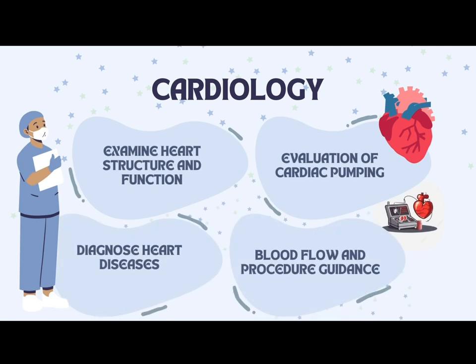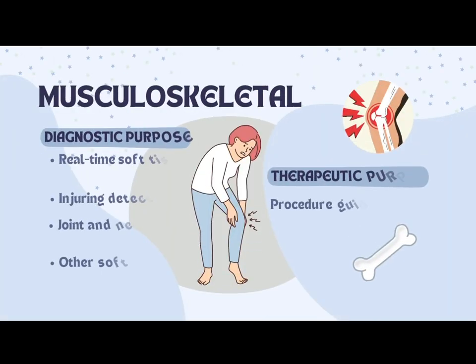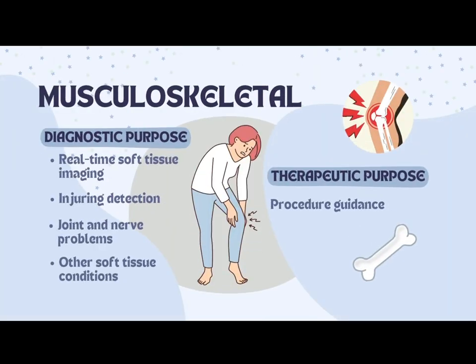For cardiac ultrasound, it is specifically used to examine the heart's structure and function. It makes it easy to view the heart chambers, wall thickness, valve condition, and measure the pumping of blood in the heart. It helps diagnose heart problems like congenital defects, valve disease, and heart failure. By using Doppler, it can assess blood flow direction and speed, detecting abnormal flow or blockage. It also guides procedures in real time, such as needle biopsies or assisting during CPR to improve safety and accuracy.